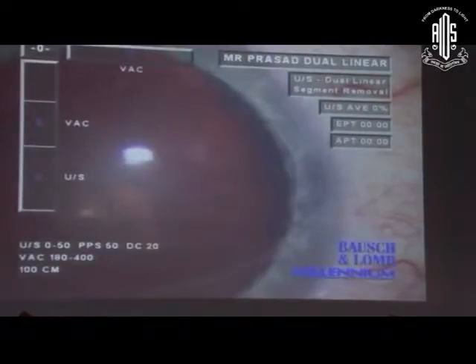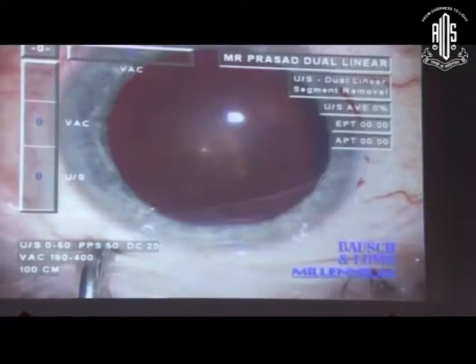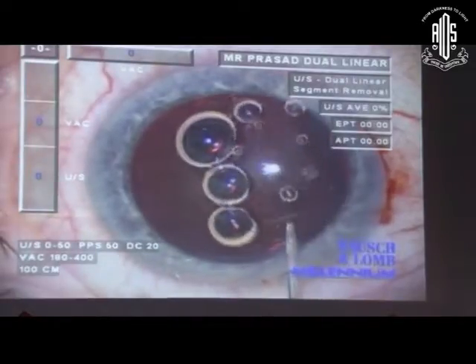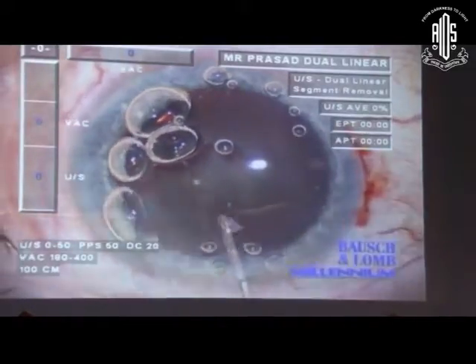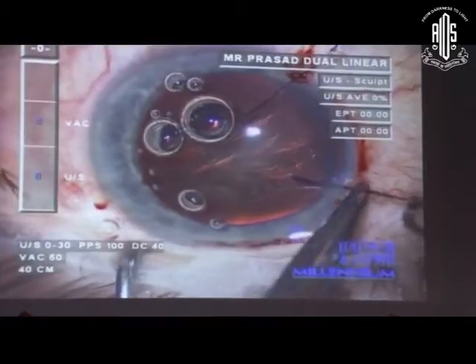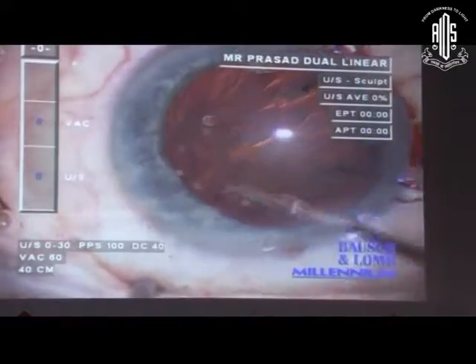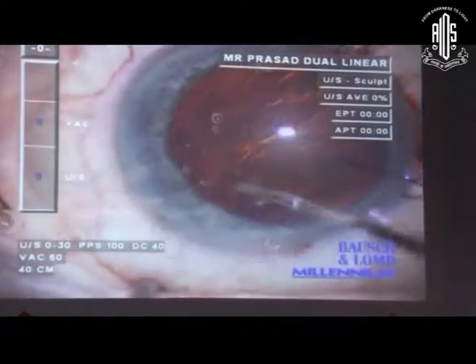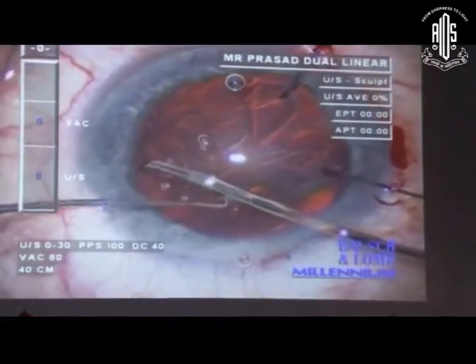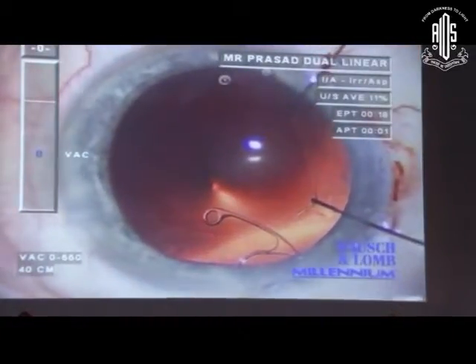Another case: simple, soft lens, where I'm even going to do a limbal relaxing incision to address astigmatism. I think it's a cakewalk — nothing to it. Well, it's not. The moment I put in viscoelastic — that's Helon-GV — he doesn't have zonule on the temporal side. So we do the same thing again: iris hooks to support the capsule, then a normal capsule tension ring, because I'm undecided whether I want to suture or not. I always feed them in manually, because the last thing you want is the trailing segment slipping into the anterior chamber. I have one instrument holding the trailing end and another tapping it into the bag.